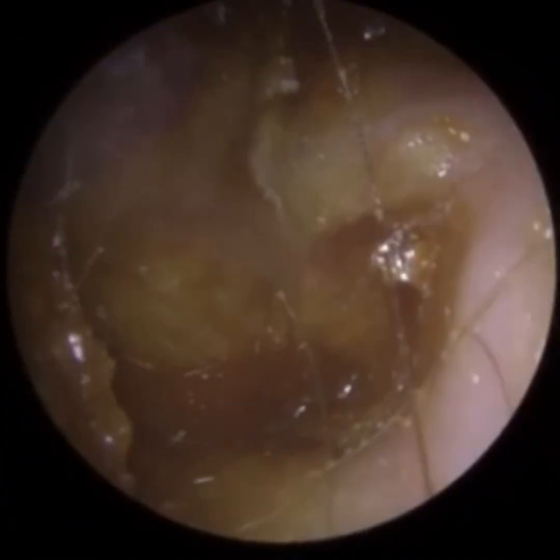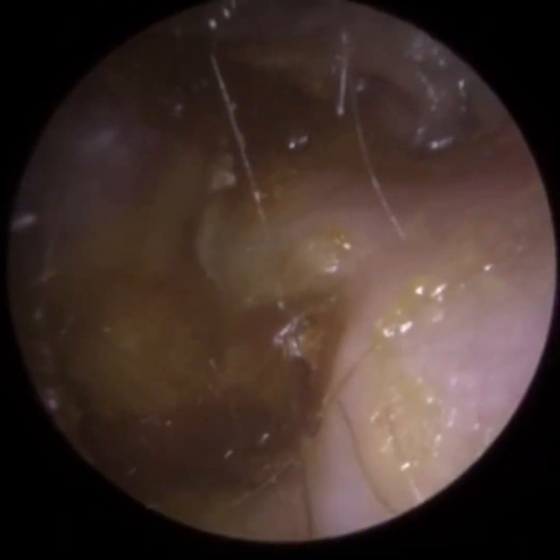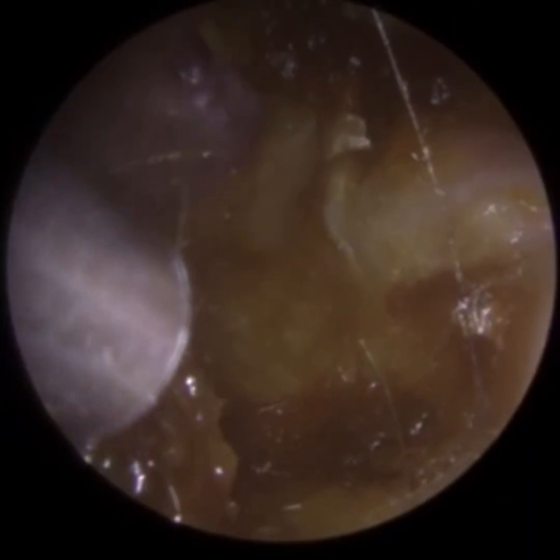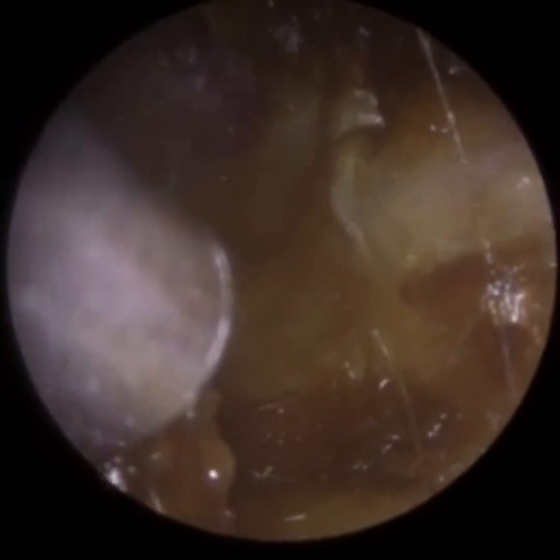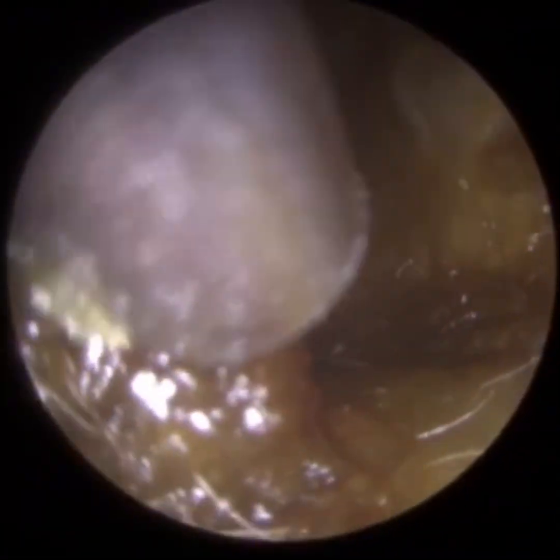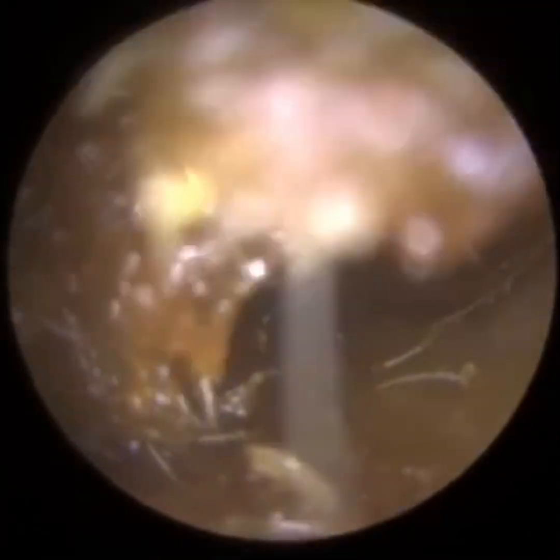So this procedure is slightly different. It's of a patient who attended with a mastoid cavity, and I'm going to explain what a mastoid cavity is, so stay tuned. Essentially, I'm just going to summarise what I'm doing in the procedure so that I can concentrate on the explanation of a mastoid cavity and why this patient has got a mastoid cavity.